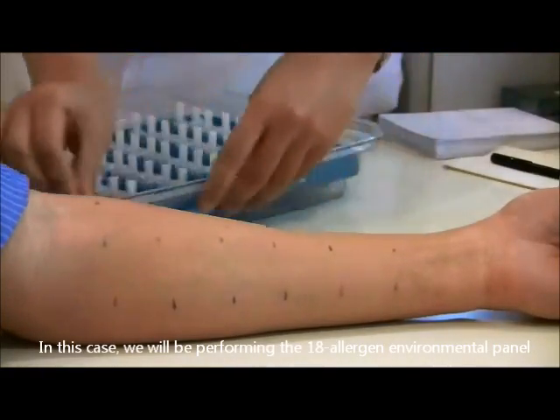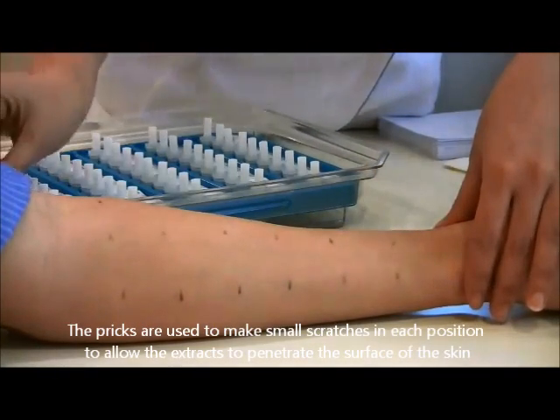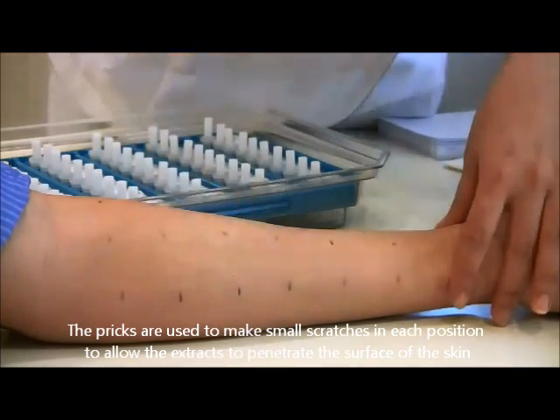In this case, we will be performing the 18 allergen environmental panel. The picks are used to make small scratches in each position to allow the extracts to penetrate into the surface of the skin.